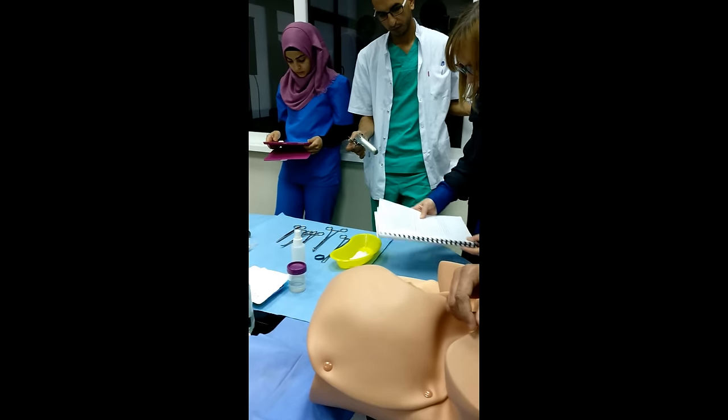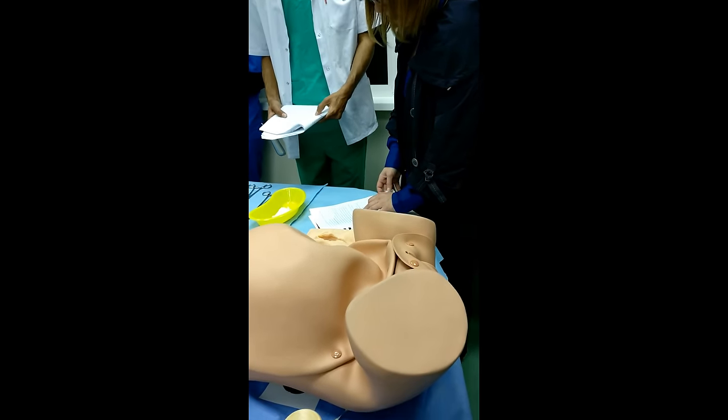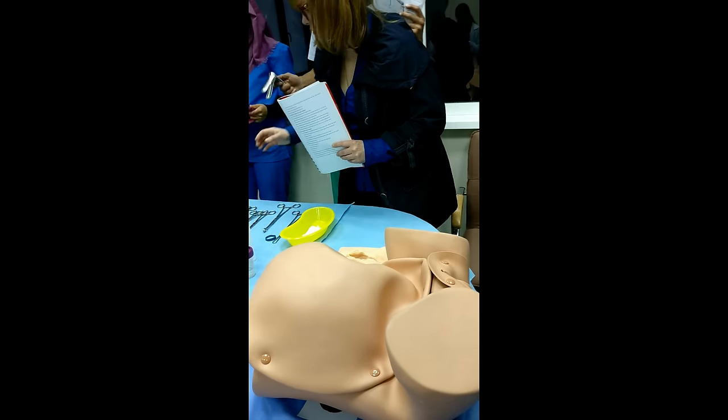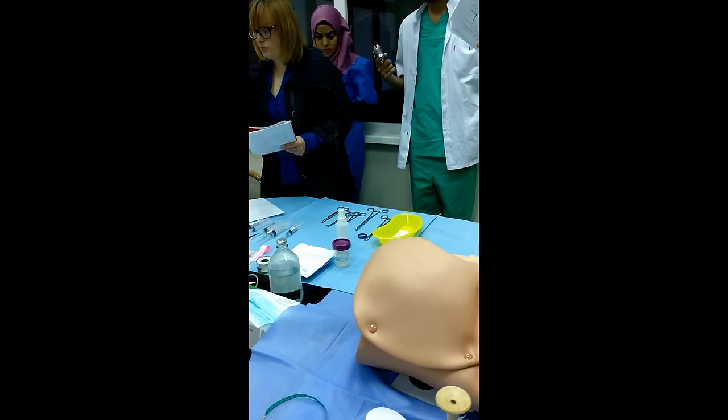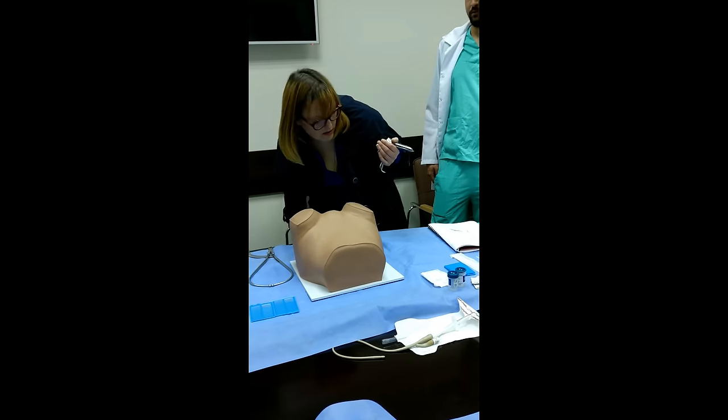In your books, you have Sims and Cusco. You'll perform just Cusco. This is the Cusco speculum. You need a light.